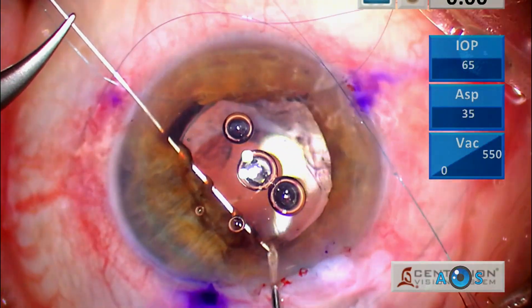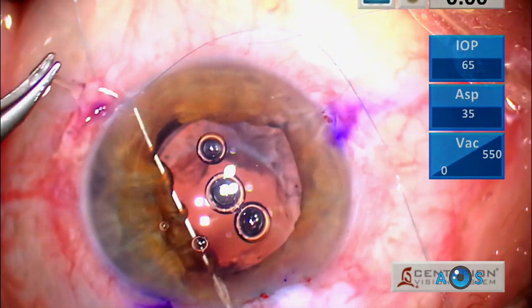A guiding needle is inserted through a superior corneal side port to retrieve the second straight needle.